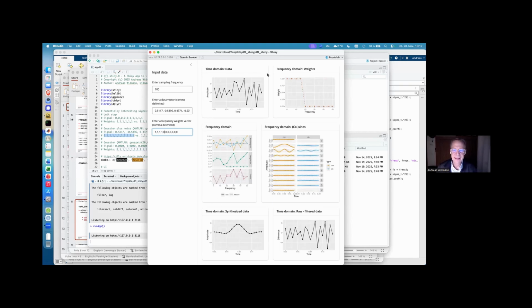Of course, that was, let's say, a bit prepared. So I added a Gaussian wave together with noise, and then I filtered the noise. So I've put the frequency components from 20 to 50 hertz to 0. I have removed them. And we just have the remaining parts, which would then be 0 to 15 hertz. And adding them back together ends in that signal. So this is the good part of filtering. So we can remove noise components by attenuating them, multiplying them by 0 in the frequency domain. That is really how filtering works.